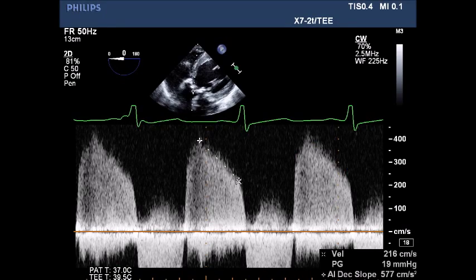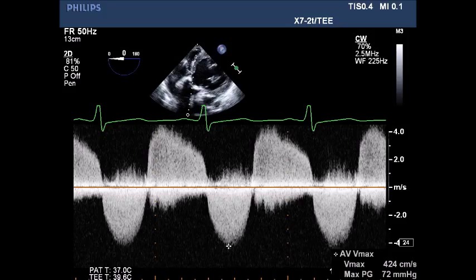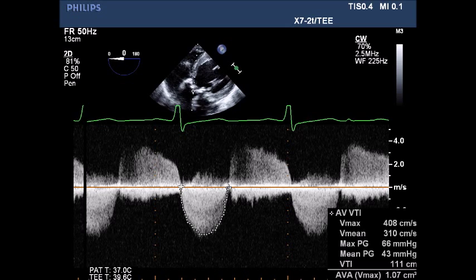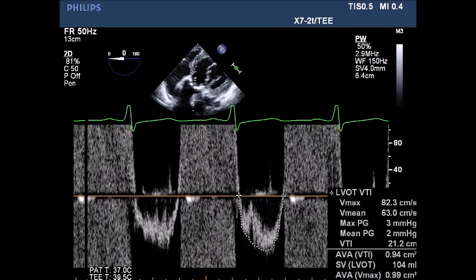Continuous wave Doppler flow showing the deceleration slope suggestive of severe aortic insufficiency, and a pressure gradient through the aortic valve of 72 mmHg. Calculation of the aortic valve area by continuity equation showing 1.07 cm². Doppler of the LVOT yields a calculated aortic valve area of 0.99 cm².